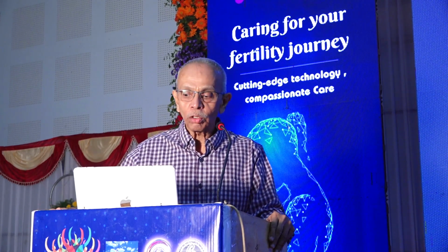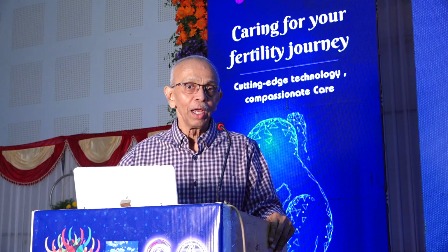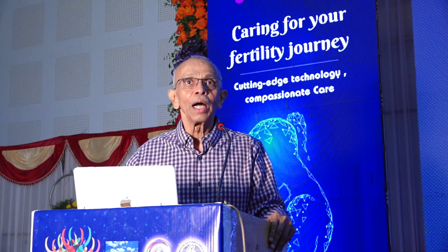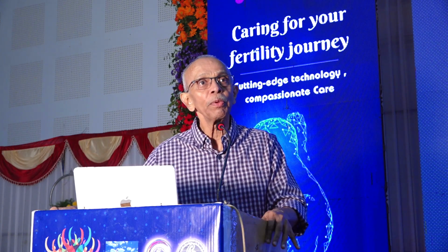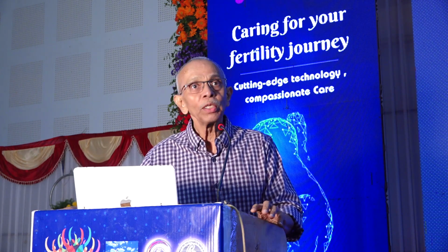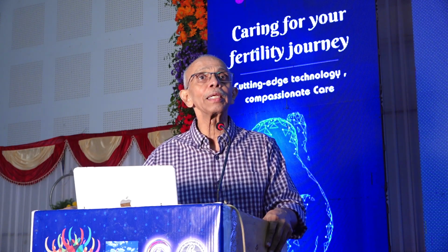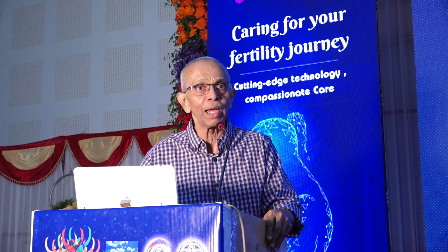Today I've been asked to talk to you about IOTA as well as the ORADs. One most important thing I would like to say is this. We all know in our day-to-day practice we keep evaluating adnexal masses, let it be an ovarian mass or an adnexal mass. The first and foremost thing which we have to sort out is to categorize them as benign or malignant lesions. That is one of the most important things that we have to do.